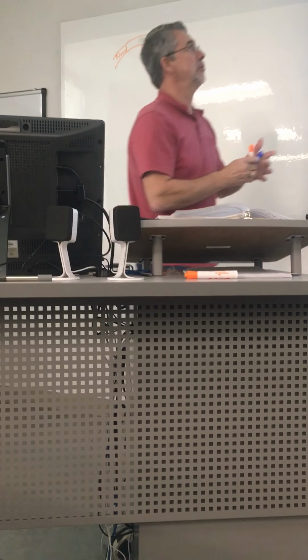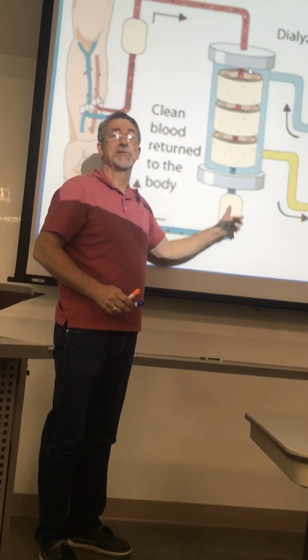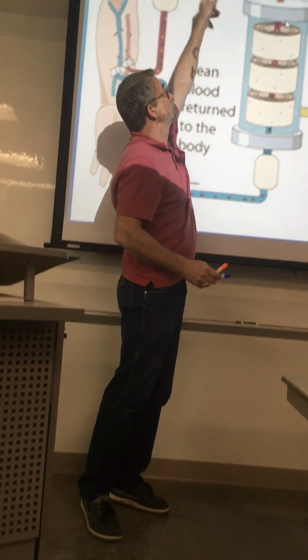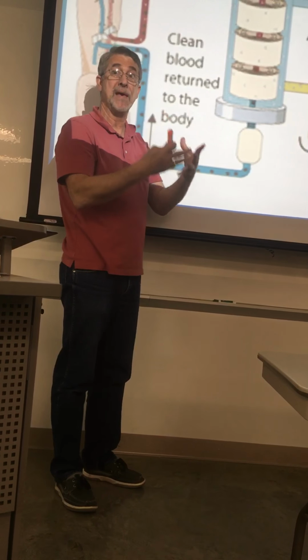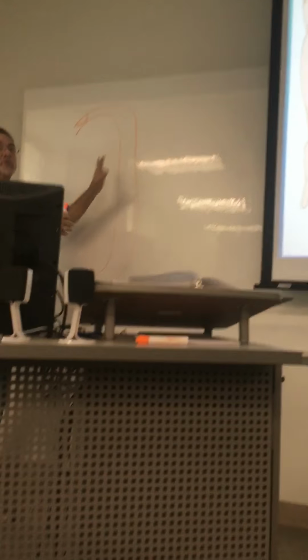They're only showing you one tubular thing that carries the blood through. In reality, there are thousands of them. This one blood input goes through thousands of tubes. So it literally is a bed of capillaries kind of thing. But we're going to draw it just as one so that we have room to write in some symbols here.